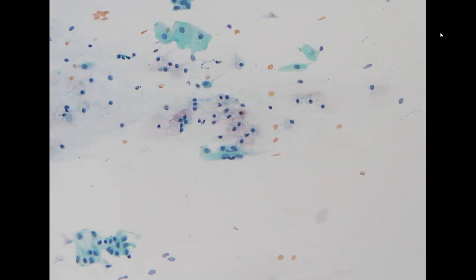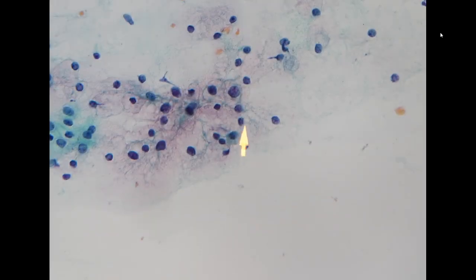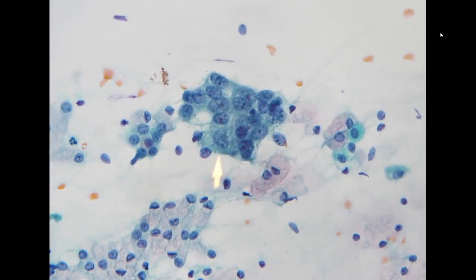So we go along with this direction, and the first thing you can notice is that the endocervical cells look really, really normal. They do not show any reactive change. In the background, there are a lot of inflammatory cells. And you start to see these out of nowhere. Again, it looks very similar.